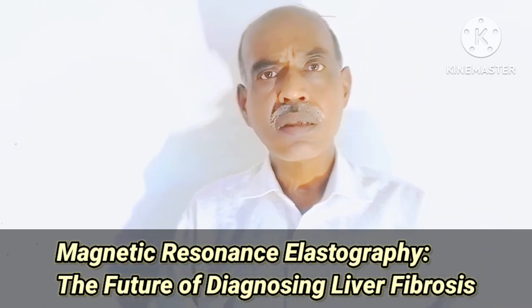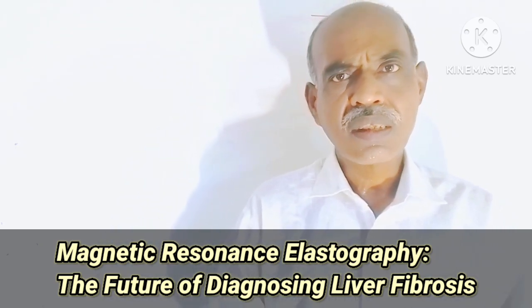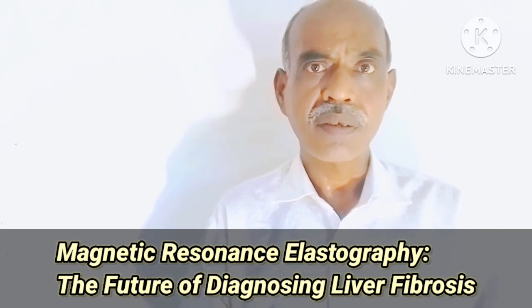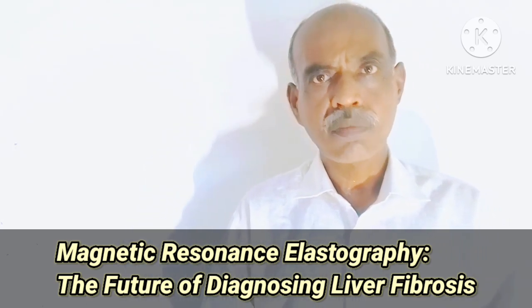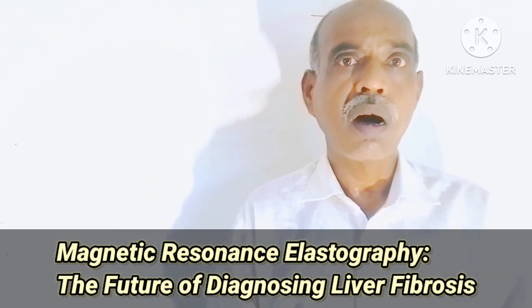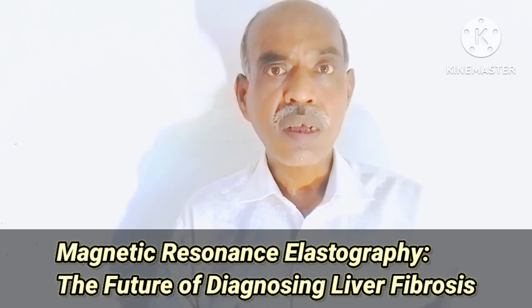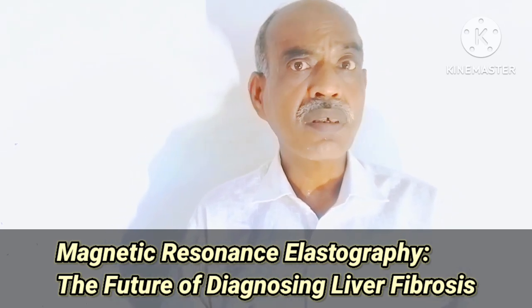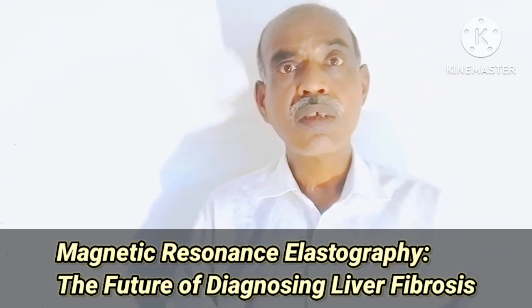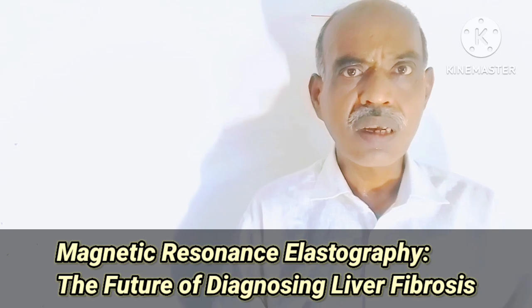When the sound waves encounter soft tissues, the movement becomes free. Sound waves can freely move for soft tissues, but for stiff tissues the sound waves cannot freely move. In that case, the sound waves are slowed down while traveling through the liver.